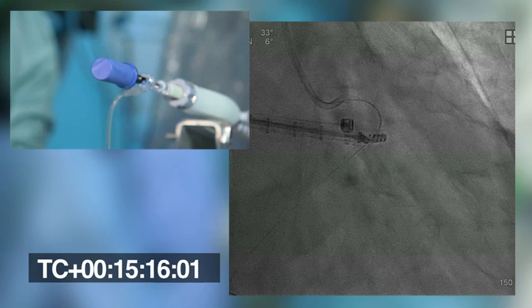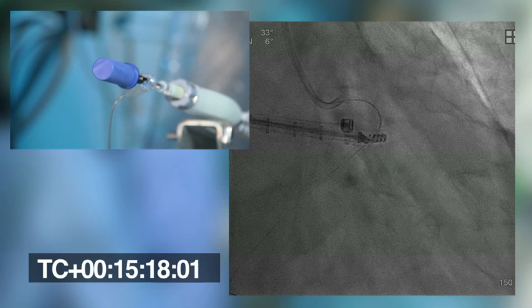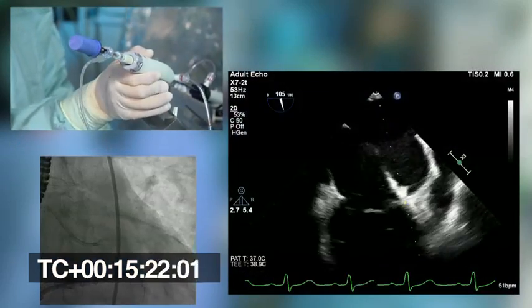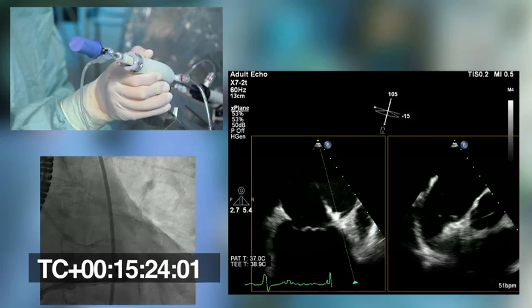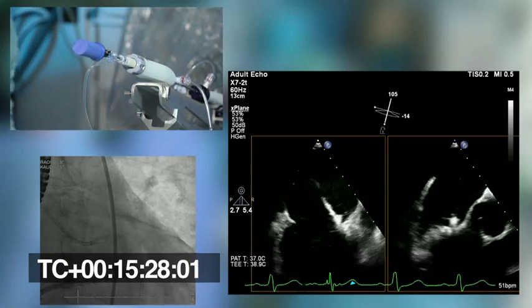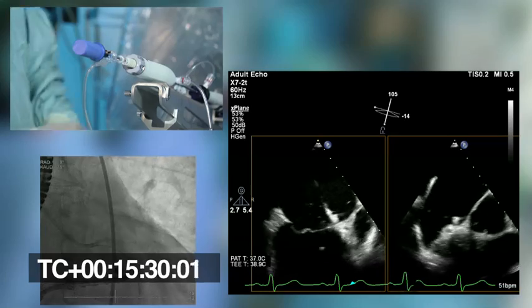All the details were good. So: first, we release the anchor; second, we remove the stabilizing wire; third, we deploy the implant by activating this knob — one, two, three clicks — getting from the first marker to the second marker. In the first part of the implant we want many anchors. The second anchor has to be very close to the first. On echo we are pretty close to the other one. I mobilize the spool to see on 3D where we are — close to the annulus.